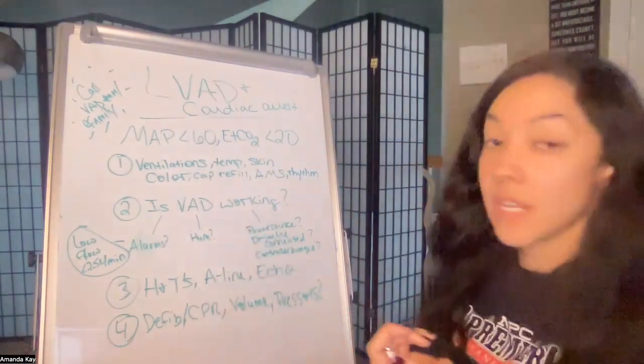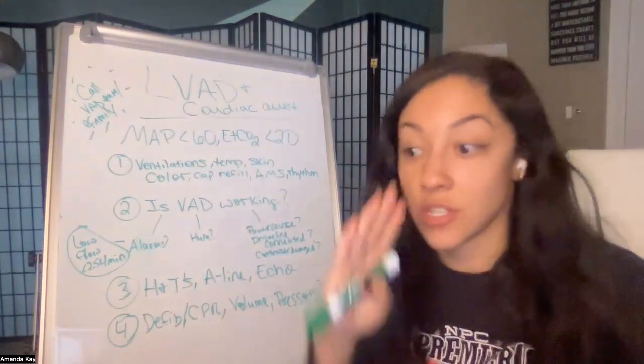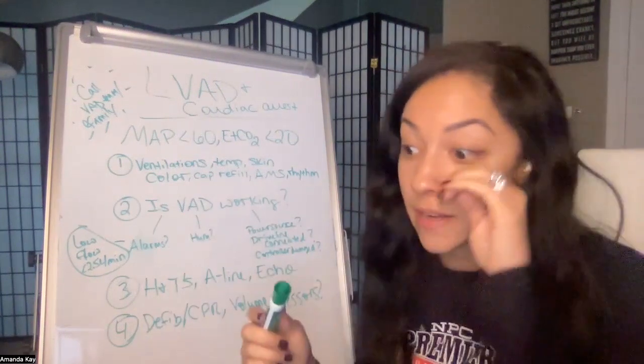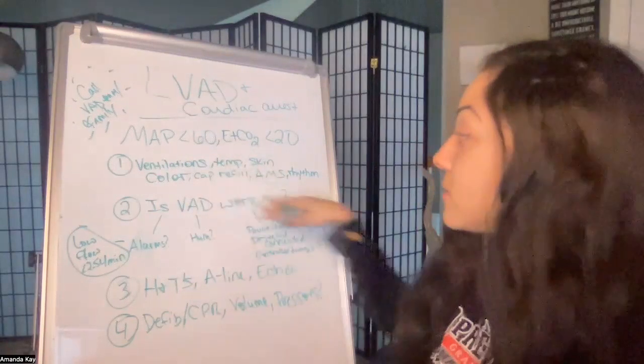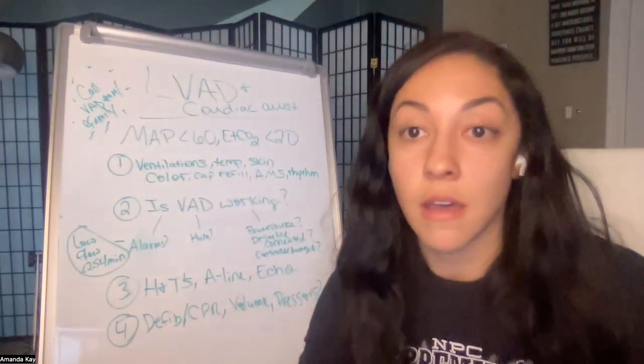And then looking at, are the batteries dead? Is the driveline disconnected? Is the controller damaged? Does it need to be plugged in? Like all of those kind of basic things we do, right? Does it need to be rebooted? What is going on, right? So looking at all those things concurrently while you're also doing your assessment of all these other things.